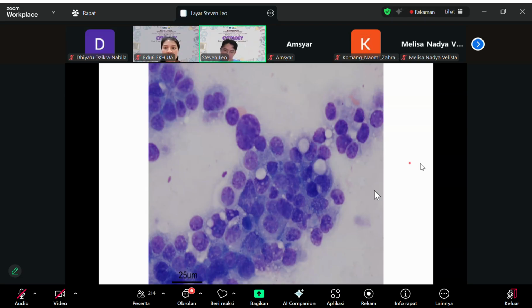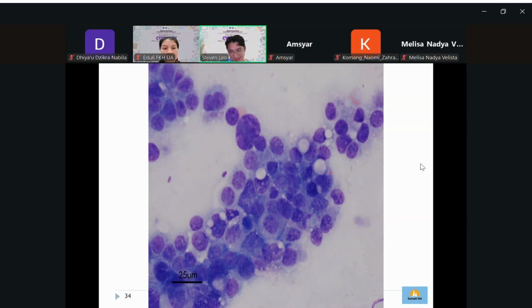Okay, round, round, round. Okay, good. Some of you said round, some of you said carcinoma. Carcinoma means epithelial, but as I told you, round cells typically don't tend to attach to each other. As you can see here, they tend to attach to each other. This one cell is attached to this one cell, attached to this one cell. So it's typically carcinoma.